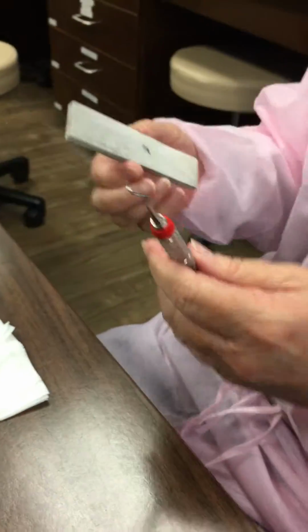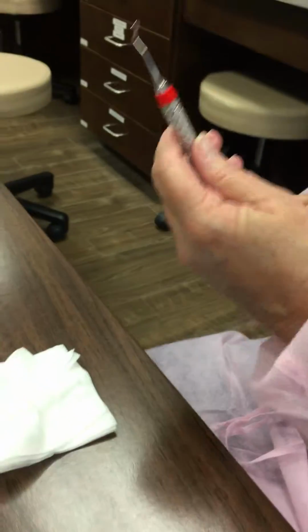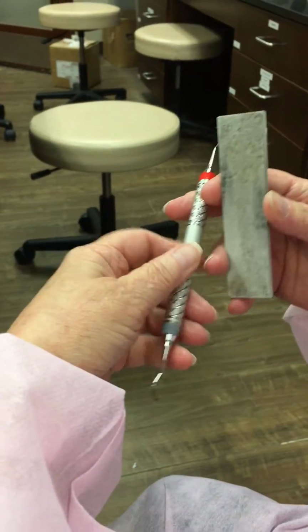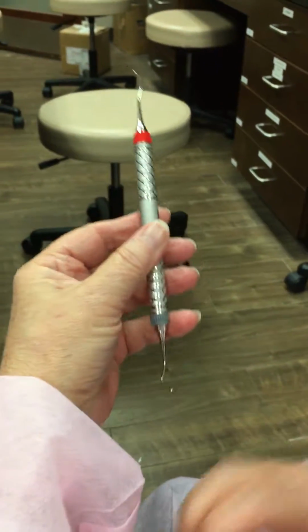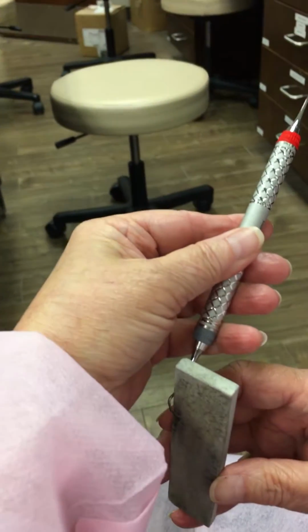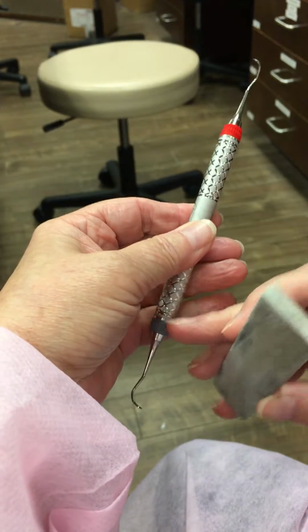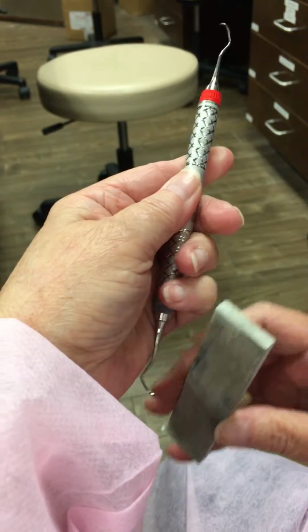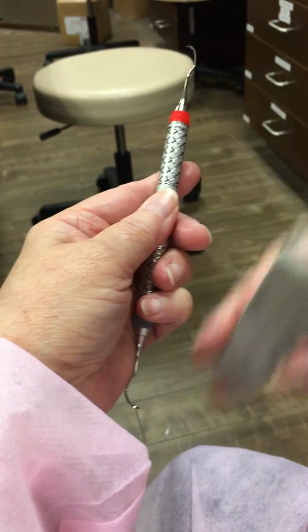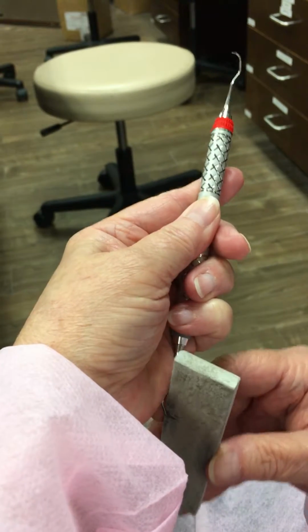Posterior sickles. I have the 204S here now, and the key here is you always want to make sure that the lower third of the shank is parallel to your stone. So your handle now is going to be flared out one way or the other. We've got double blades and double ends, so we're going to have to do all four. We're going to start here.